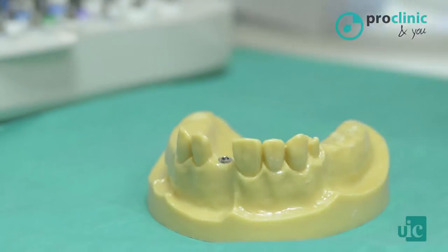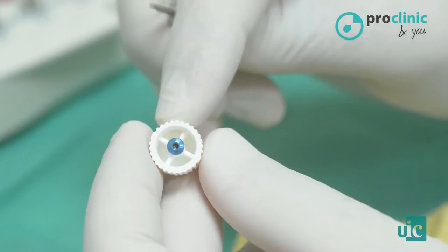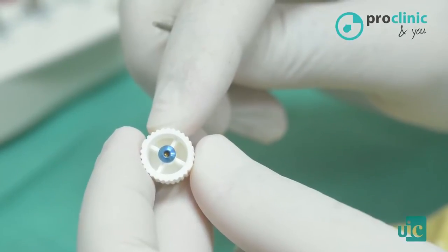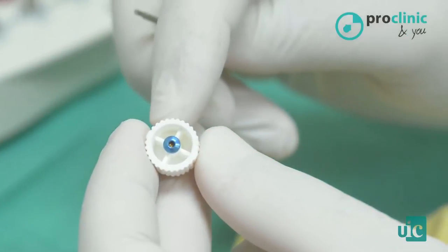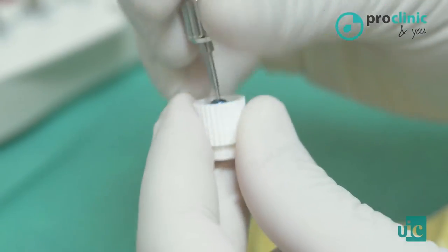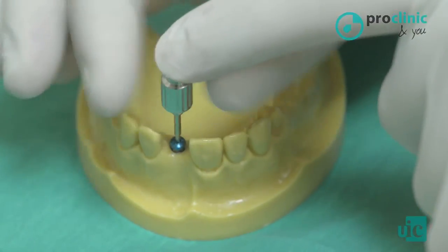Now we place the cover screw of the implant. We can see how it is codified by a color system that makes it easier to identify its diameter, platform and the prosthetic abutments to rehabilitate each case. This is all the prosthetic arsenal that we are going to need to rehabilitate this case. We remove the cover screw from its blister and we screw it on the implant connection.